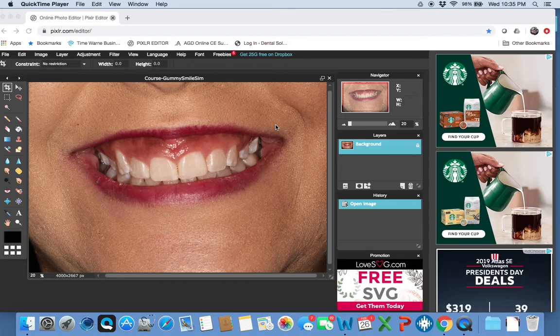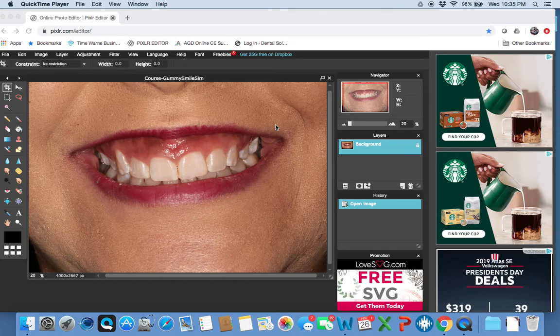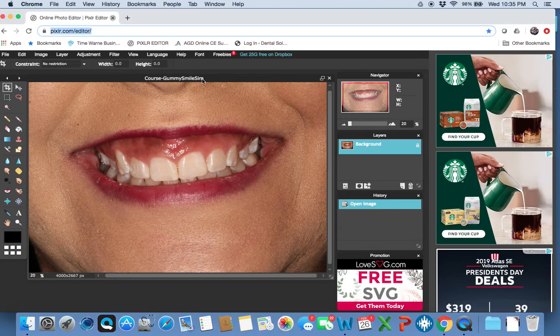Now, Pixlr, if you've never used it before, is strikingly like Photoshop, and dentists will really like this because it's online and it's free. There's no subscription cost. There's no cost at all. So let's get into it.